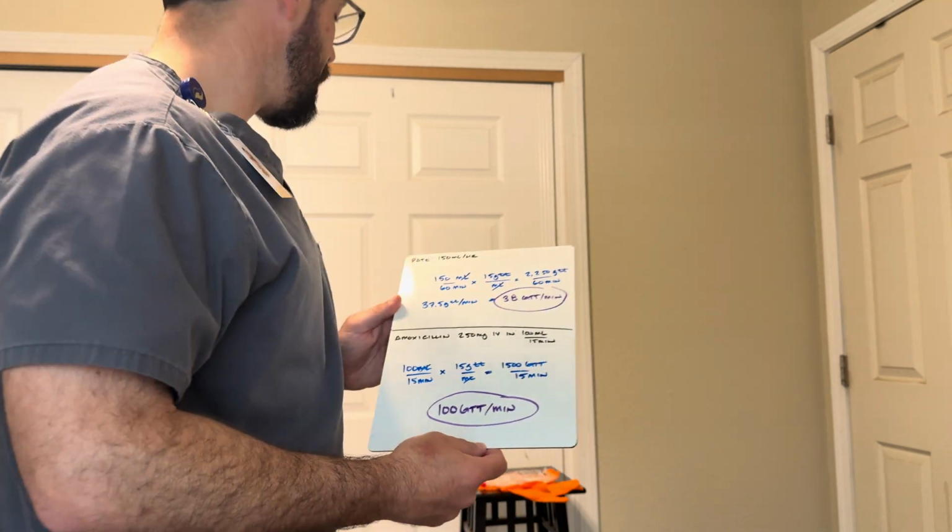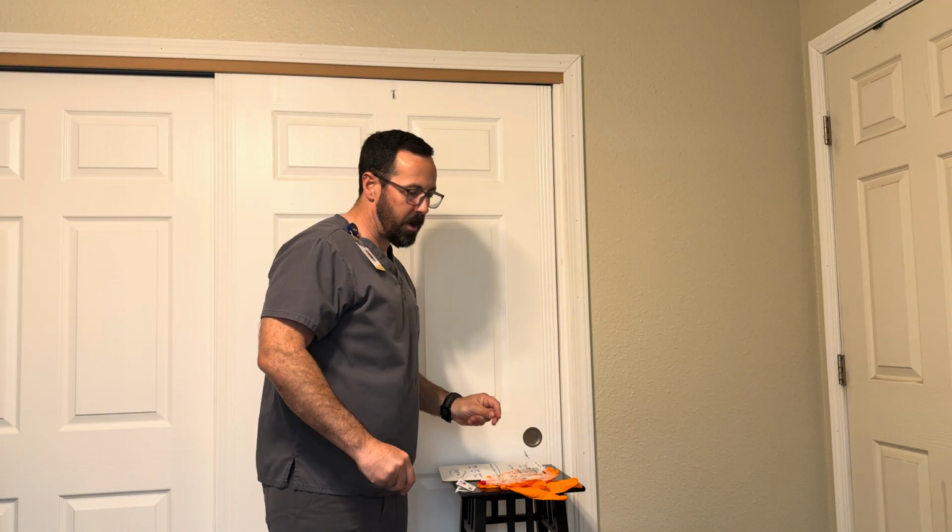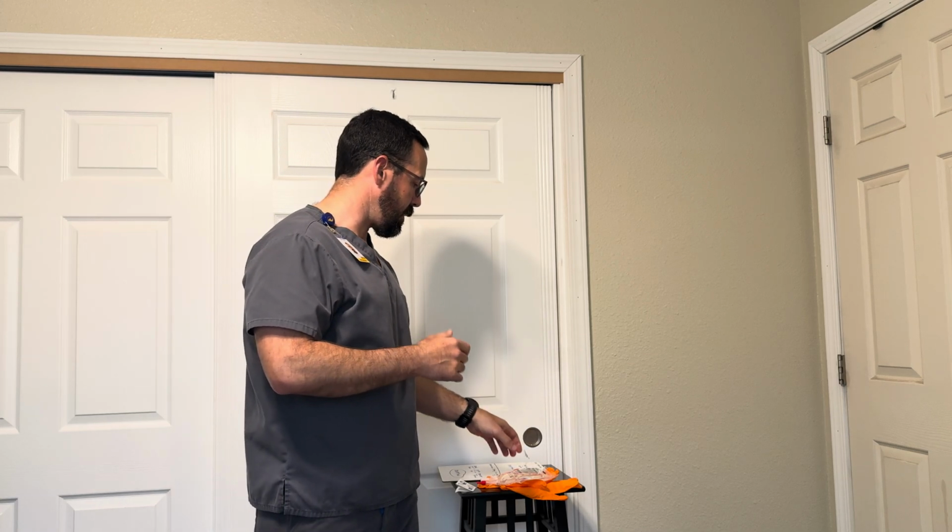Okay, so the very first thing is going to be to get everything out of the Pyxis. Once I pull the amoxicillin out of the Pyxis, I'm going to check it against the MAR, wash my hands, and don gloves. So I'll do that now.